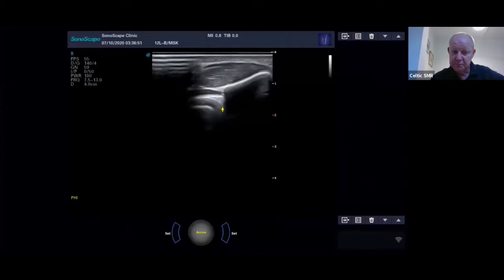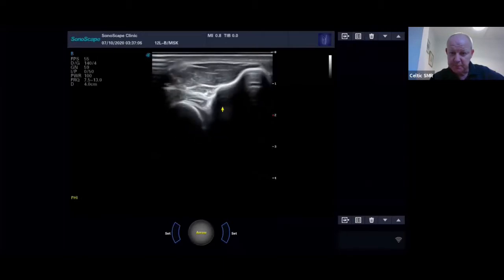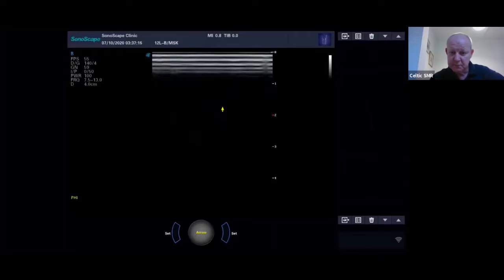Yeah, you can see that moving. Got good movement there. Good image. Okay, so it's usually one transducer length up and then one transducer length across, and that should get you right in that spot. Okay, and that pretty much is the distal biceps tendon and the long biceps tendon.